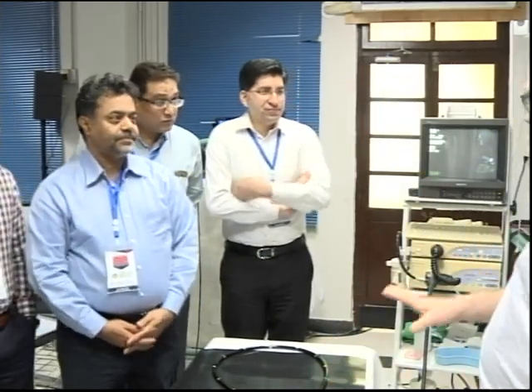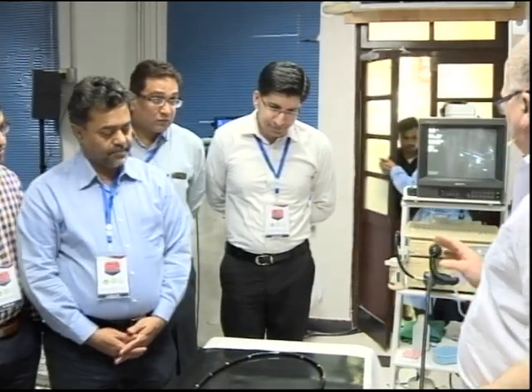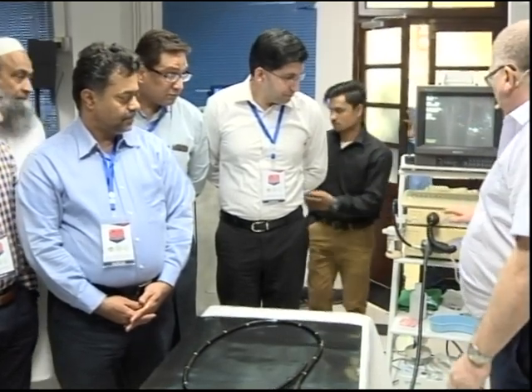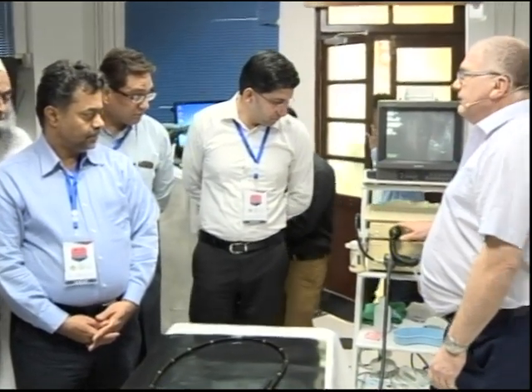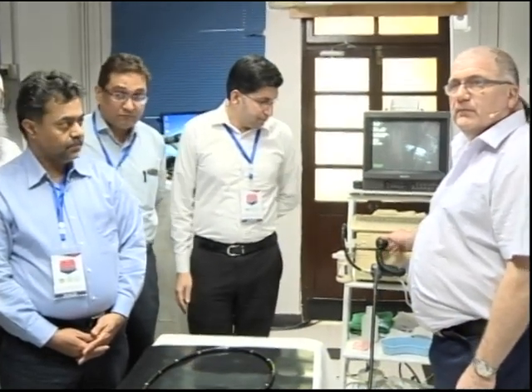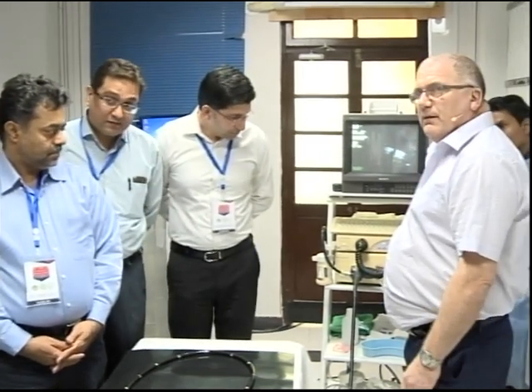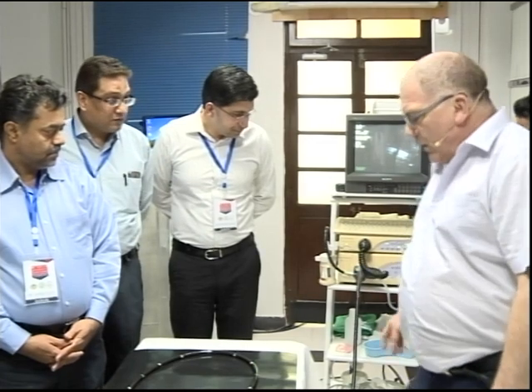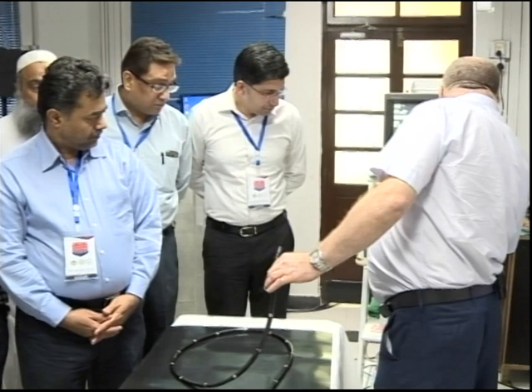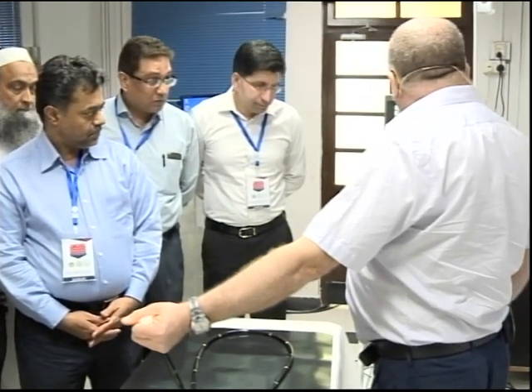Chaps, when you're handling a colonoscope, you need to know what the scope can do. And in knowing what the scope can do, you need to understand what this is. So does everybody know what this is? What is it? What's this? Okay. So, when this is actually working, we put the light on, and we see colour.